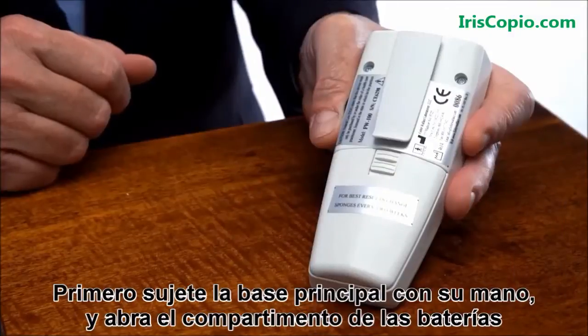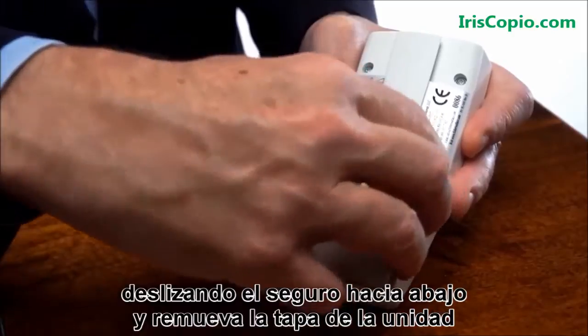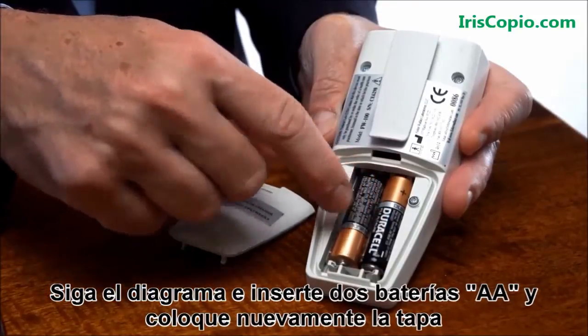First, place the base unit in your hand and open the battery compartment by pushing the locking slide down and lifting the back case off the unit. Following the diagram, place the two AA batteries in the compartment and re-close the case.